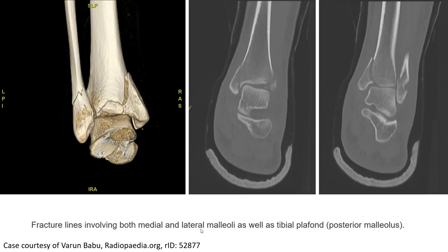On the CT scan, we can see the fracture line involving both the medial and lateral malleolus, as well as the tibial plafond, which we call the posterior malleolus. So this is a trimalleolar fracture.